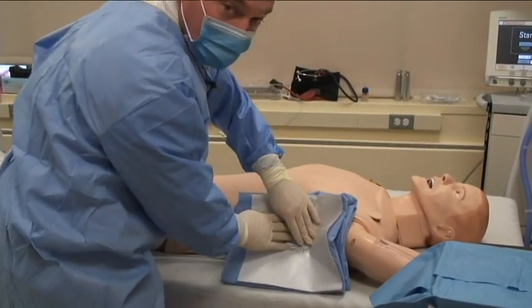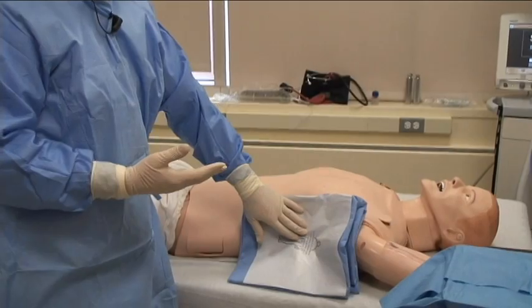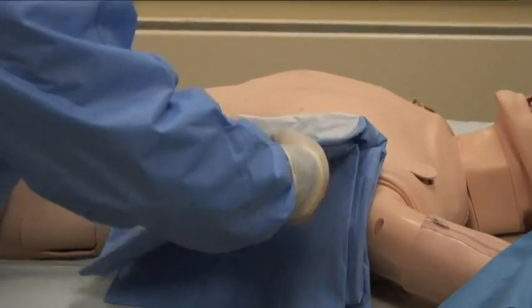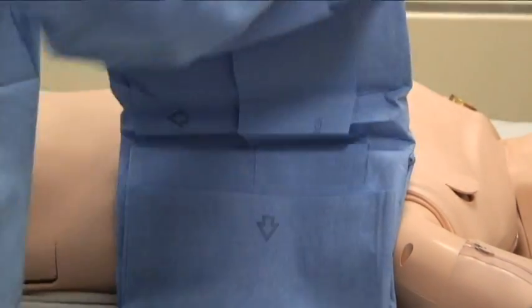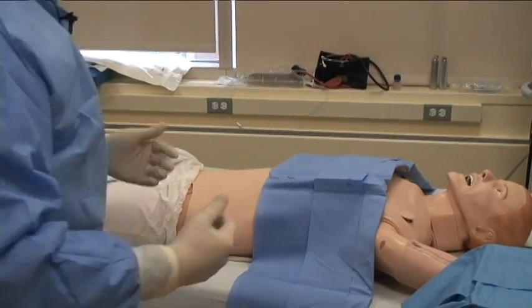Again, it's going to be mid-axillary line is best done. To put them posteriorly, sometimes you need to if there's a certain collection of fluid or pneumothorax. But unfortunately, that's very uncomfortable for the patient, as when they lie on their back, it sort of gets in their way.